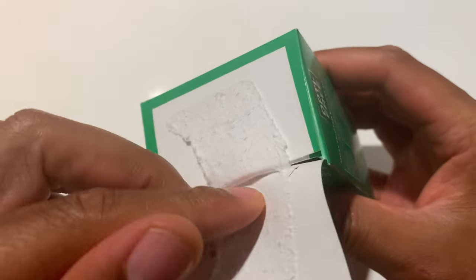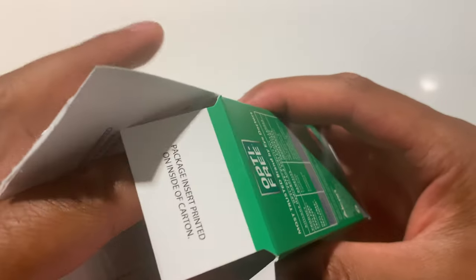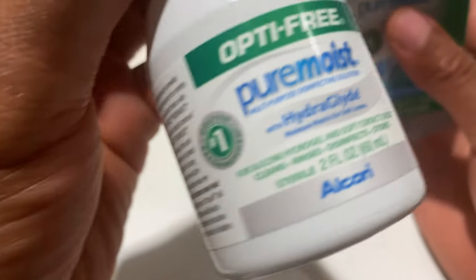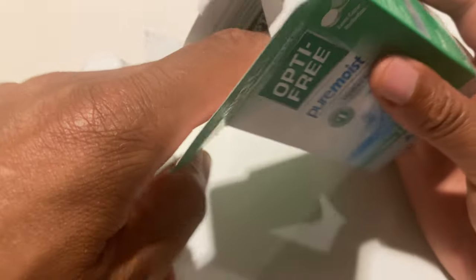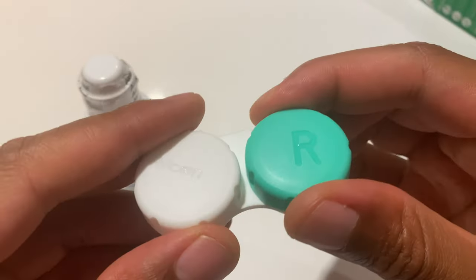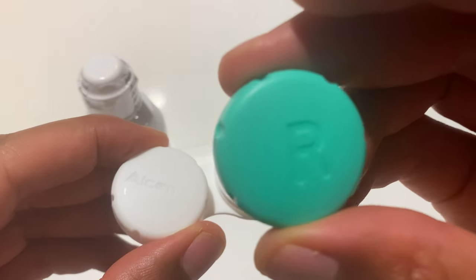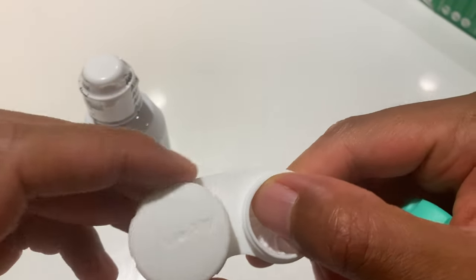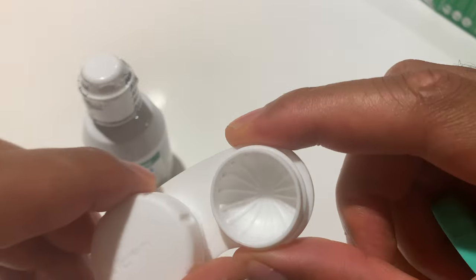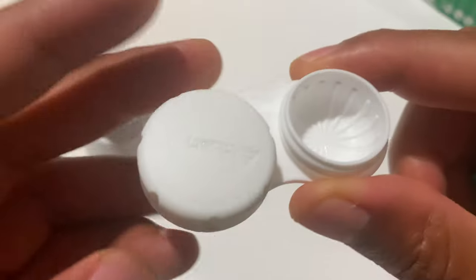I'm going to go ahead and open this up. Opening from the top — inside is the Optifree moist solution as well as a container to put the lenses in. The R stands for right, and there is no L that represents left, but I'm assuming that this is it right here because there is no other cap.